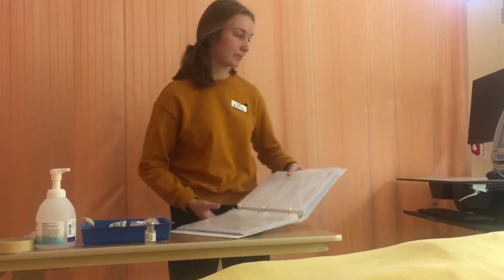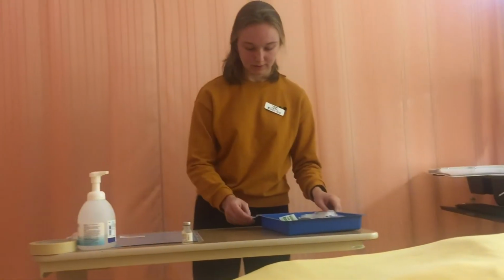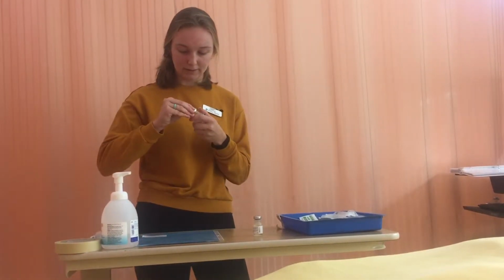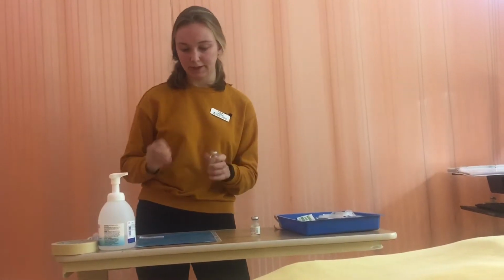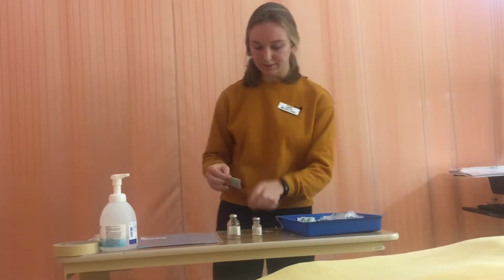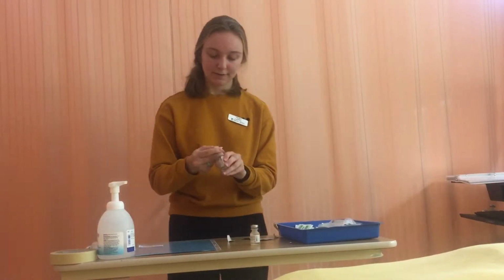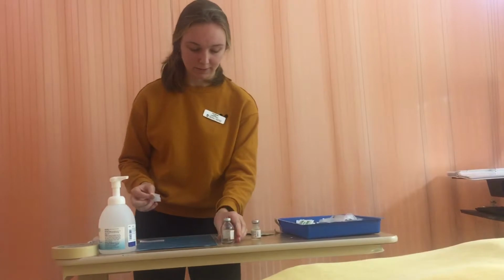So I'm just going to put my drug monograph to the side, and now I'm going to start preparing my medication. So I'm going to get my vial. I'm going to open it up. I already had washed my hands previously before handling the medication, so I know that my hands are clean. So I'm going to get my alcohol swab. I'm going to open it up and swab for 30 seconds and dry for 15, but for the video I'm just not going to do the total 30 seconds.